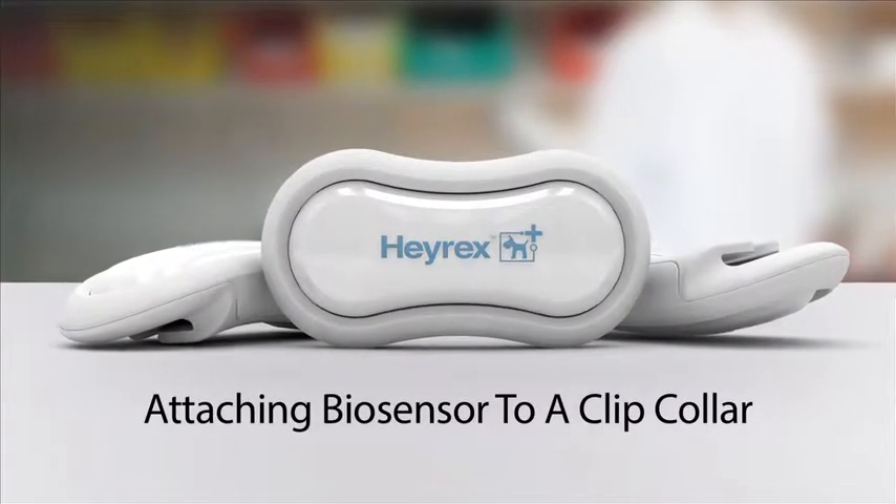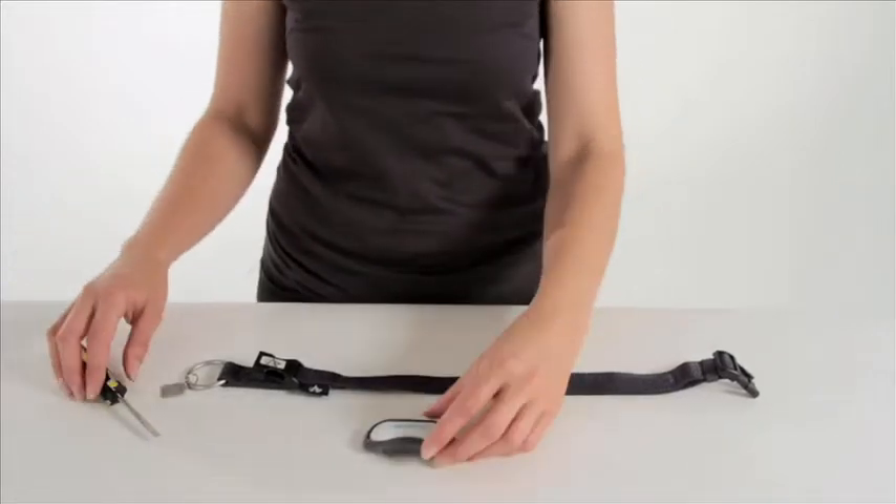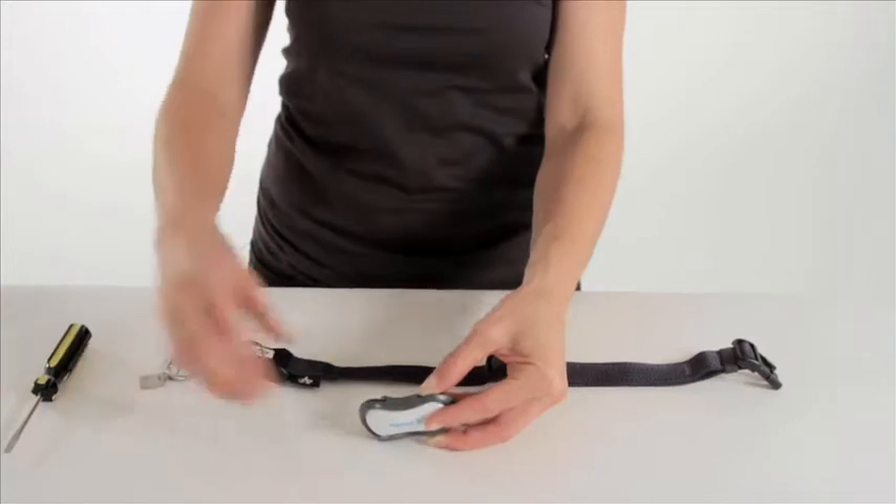To attach the biosensor to the collar for a clip collar, first remove the biosensor from its surround. Turn the biosensor over and insert a flathead screwdriver into the small slit and gently twist.